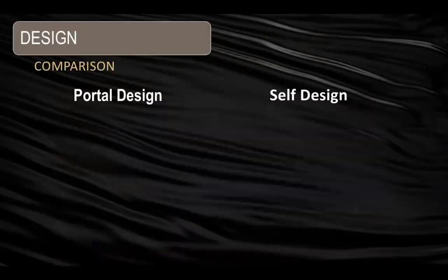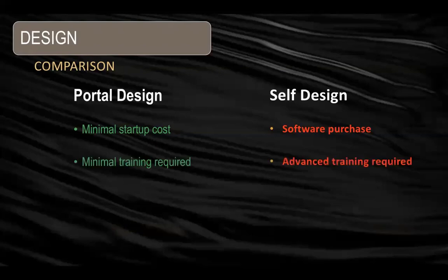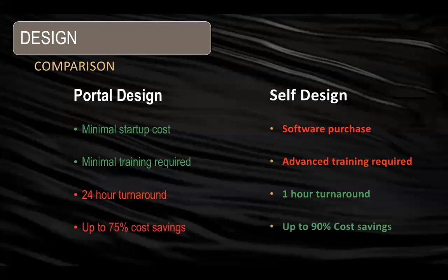When it comes to design, you have to make that choice of whether you want somebody else to design it, or do it yourself. There are pros and cons. If you use a portal, you're not going to have to spend as much. With self-design, you have to learn a lot along the way. But I like the idea that I can get a wax-up done in an hour. Let's say somebody breaks a back tooth and they have nothing for me to refer to. I can do a wax-up of back teeth in 5 minutes now, and we print the model, do a putty matrix, and we're ready to roll in just an hour or so. That really helps.